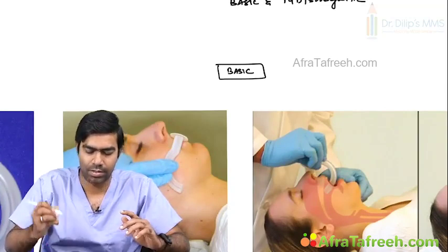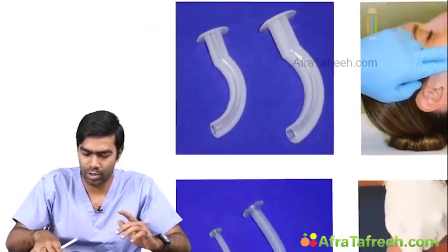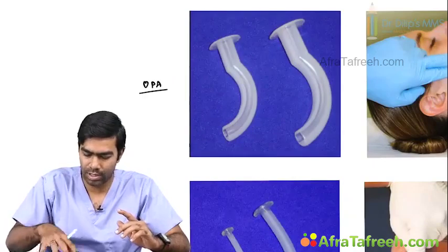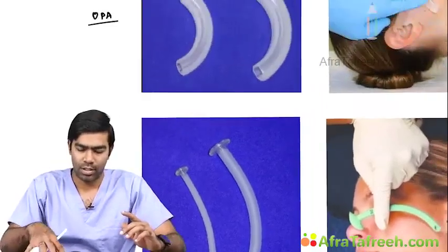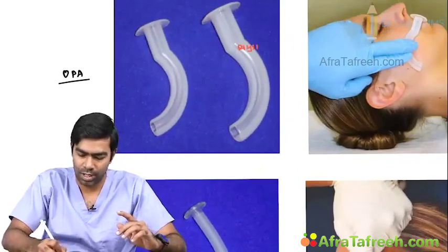Basic airway devices. Clear? So I told you only two basic airway devices are there. One is your oropharyngeal airway, and the second one is the nasopharyngeal airway. Clear? So in these oropharyngeal airways, you can see they are very rigid tubes. They are very, very rigid. They are plastic tubes. Why?